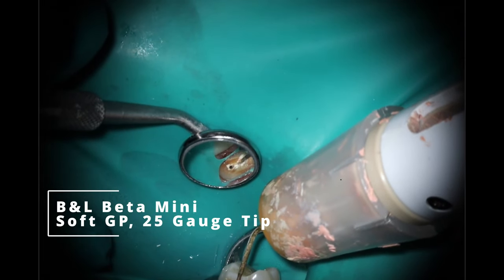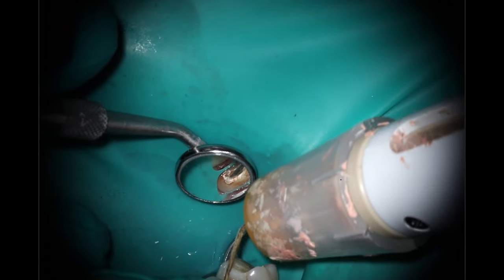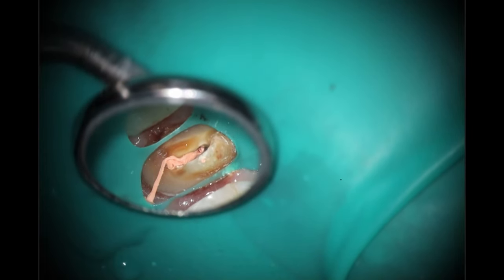Going in with the beta to do the actual squirt technique. I'm going to be doing posts in both canals because I have access and they don't converge — the only time I don't like doing two posts is if they converge too much. I'm trying not to fill all the way to the top so I don't have to go back and clean it out to create post space. If we were not doing the buildup, this would be the easiest case ever — I'd be done in seven minutes with the root canal, which is pretty awesome. The buildup is really what took the extra time, and that's why I recorded this one.